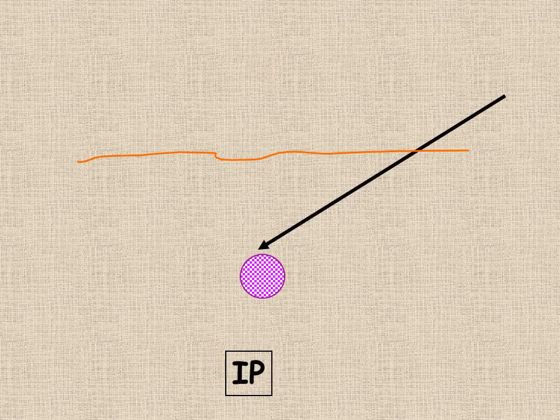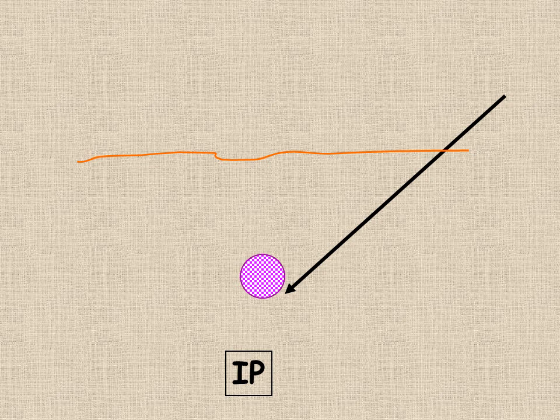Conversely, for an in-plane approach, we'll aim for the top and bottom of the nerve, rather than aiming again for the center of the nerve.